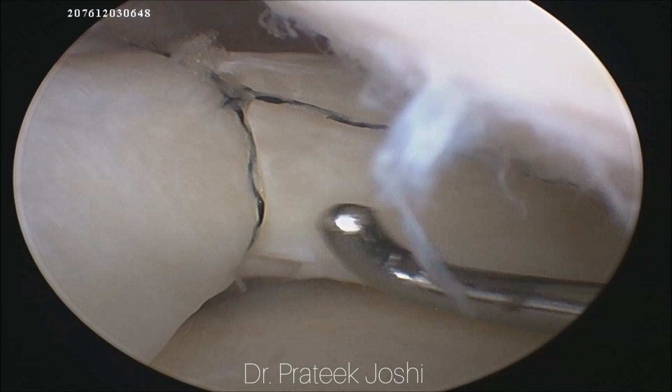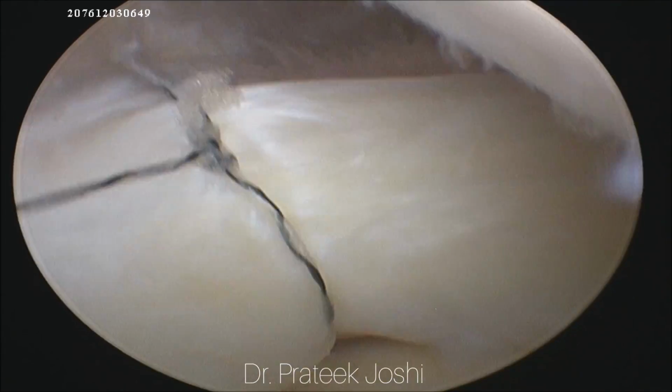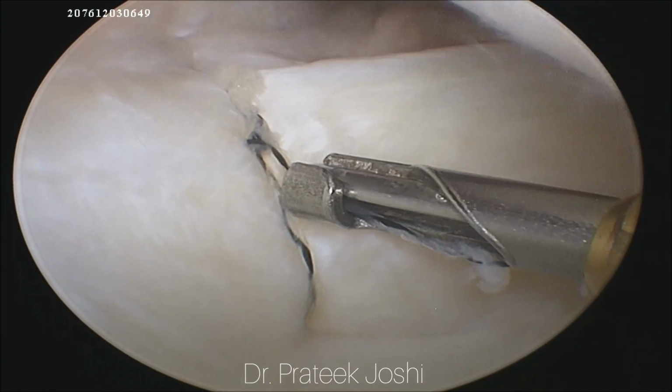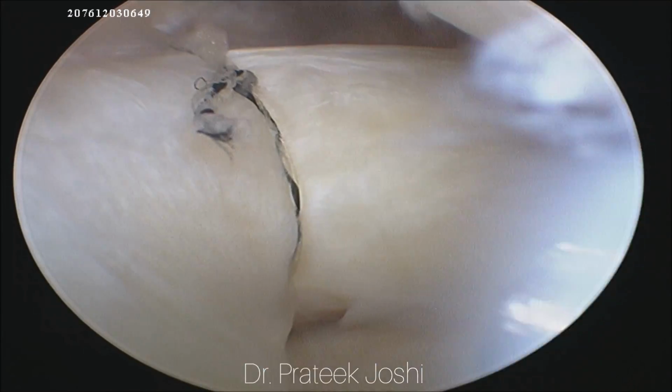So now the meniscus is sitting properly, and now I am going to pull the thread to tighten the knot, and then I am going to use a knot cutter to cut the thread. This completes our first all inside suture used for the posterior horn of the lateral meniscus.